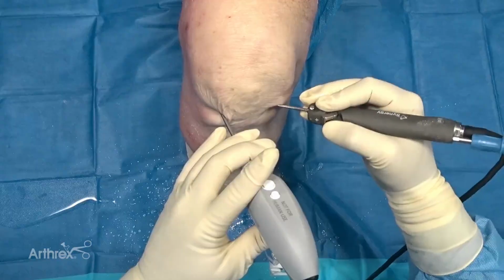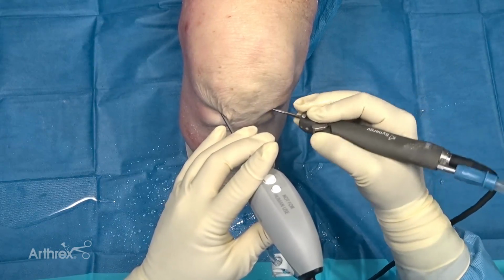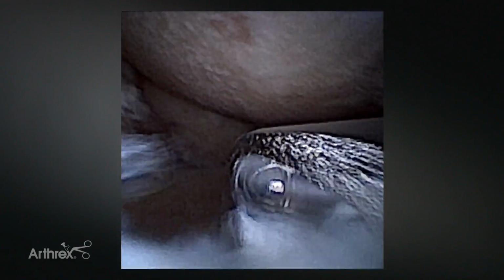you can see how aggressive this is through these percutaneous holes and incisions basically. And again, we're getting all the way on the other side of the knee from a medial portal very easily. Very aggressive, and you can see that it's not chopping up the meniscus. It's doing a very nice job at being anatomic on its resection while still being aggressive. So I love that. We're going to come forward here.